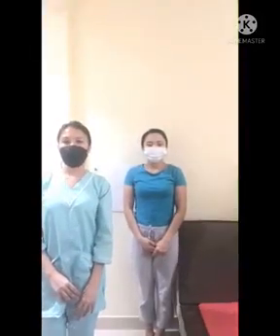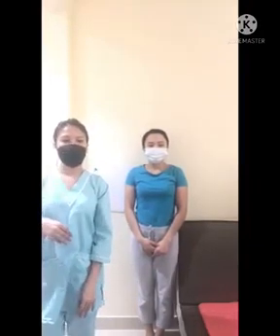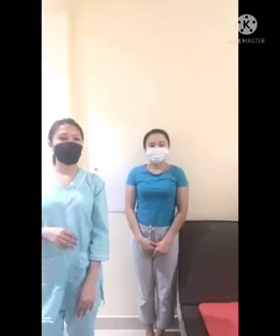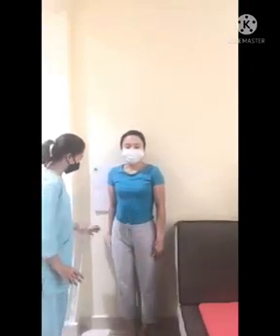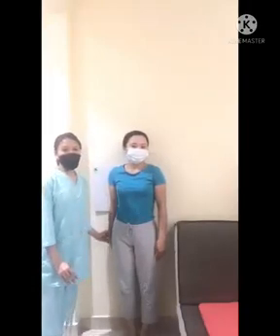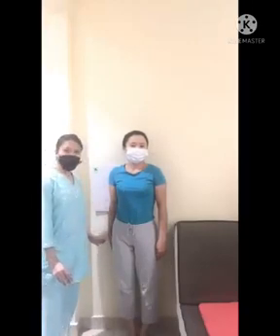So, the image receptor is 10 by 12, and we have the secondary marker and the meter stick. What we're going to do is the AP internal rotation. The patient is in the same position as the upper, but the hand is internally rotated until the back of the hand is resting on our hip.